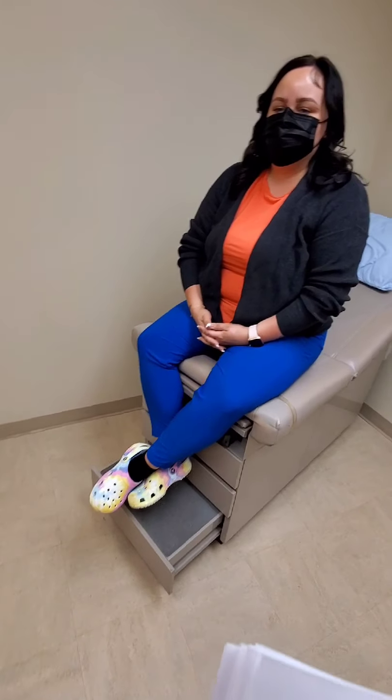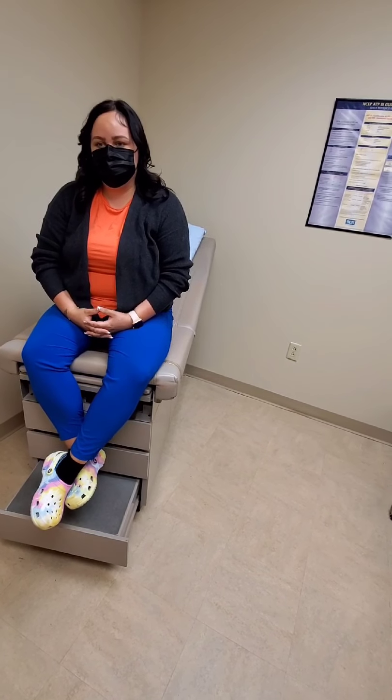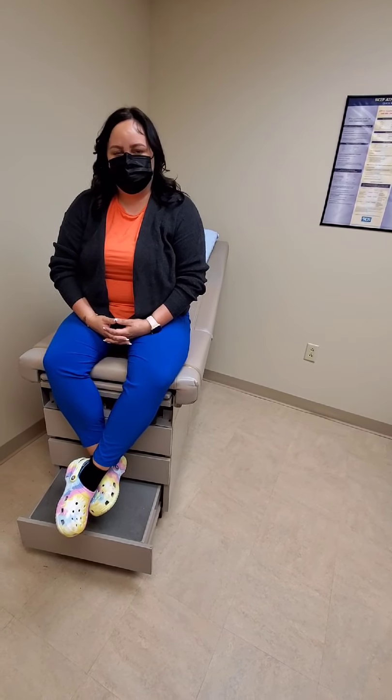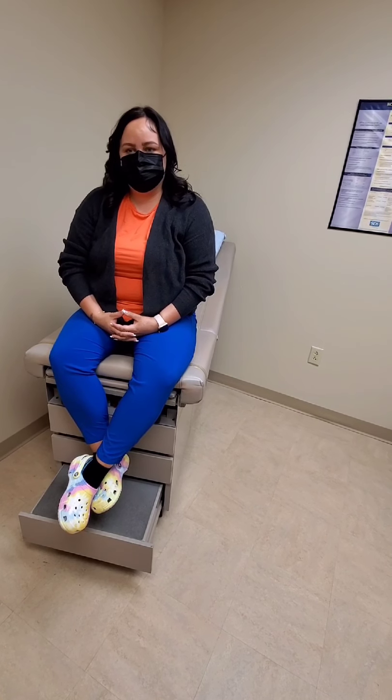Today we're going to do the physical assessment. So I've knocked on the door and the patient has allowed me in. I'm going to wash my hands with soap before starting my examination. So we have Mrs. Jackson here. She's arriving here as a new patient, so we're going to do her first exam. The first thing I'm going to start with is to measure her blood pressure.